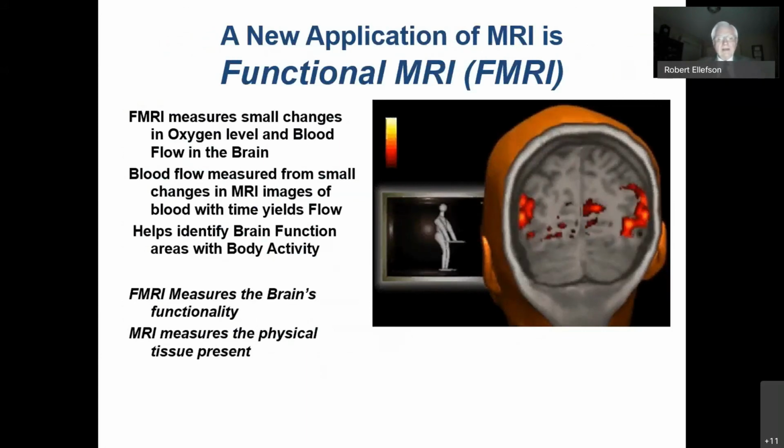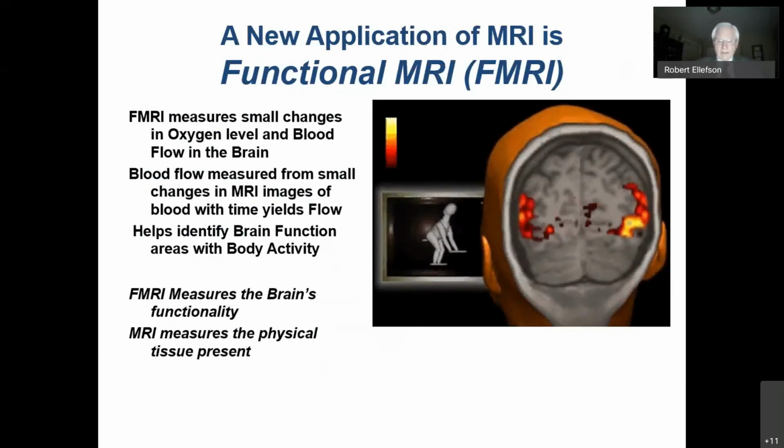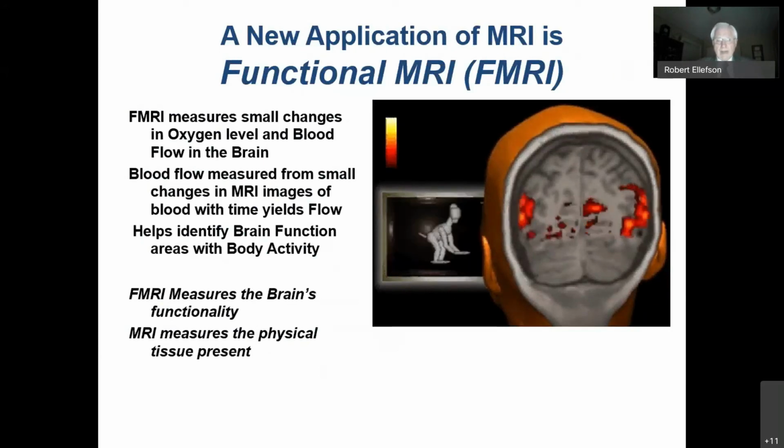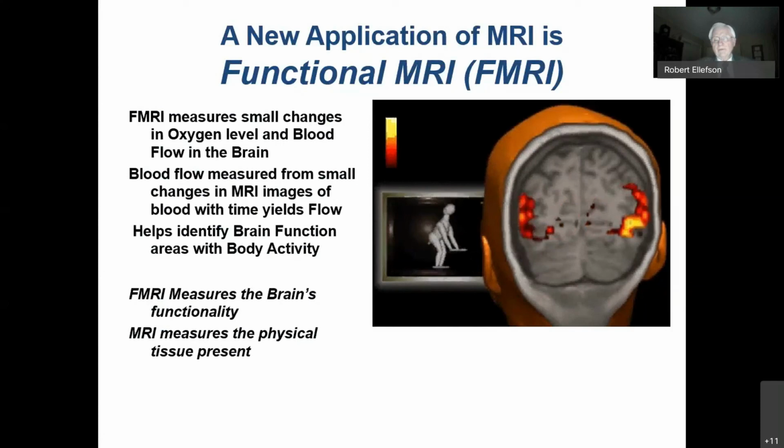And this can identify our brain function here as this person is looking at someone doing exercises on a screen. You can see that different areas in the brain light up as the information is processed. And then the pattern triggers something totally different. And this is something interesting that they are, quote, understanding.